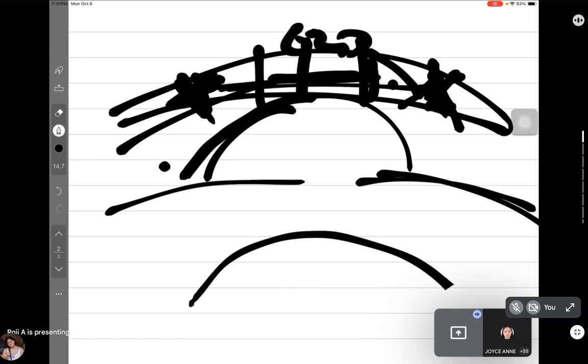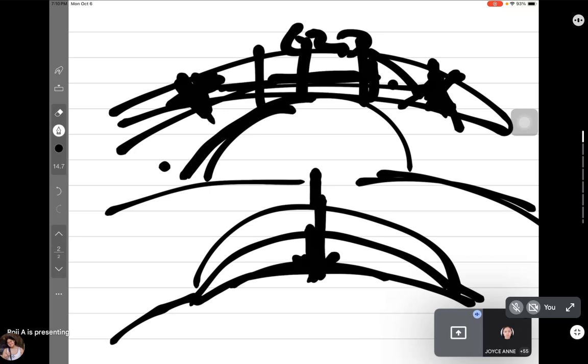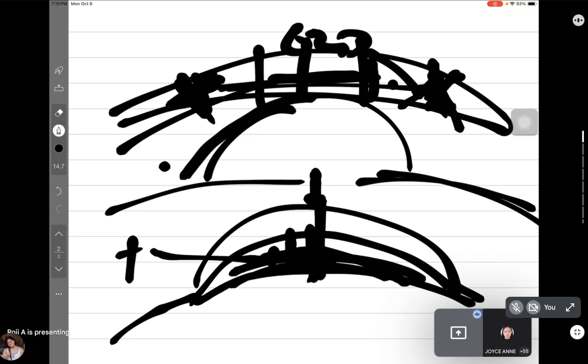To compare with a steep fit, every time you blink, this pushes the contact lens near the cornea. That's why the plus lens that is created under is pressed down to almost nothing, and that creates clarity. Correct? No questions?